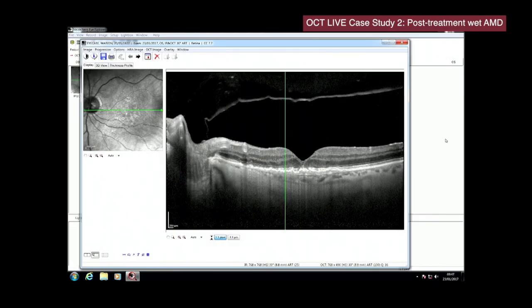So when we're thinking about subretinal fluid, the first thing that immediately springs to mind, obviously, is wet macular degeneration and choroidal neovascularization as the cause. To that list, I think we also need to be thinking about other possible causes. So again, it could be choroidal neovascularization secondary to high myopia. Okay, that needs to be added to your list. A very common presentation to optometric practice, obviously, is patients with central serous retinopathy. Increasingly, though, we're seeing CSR in older subjects.